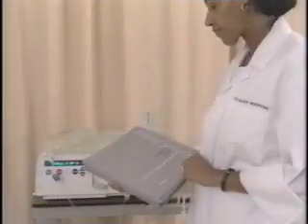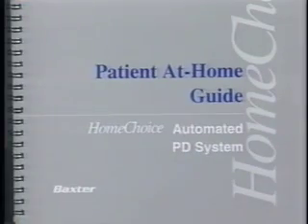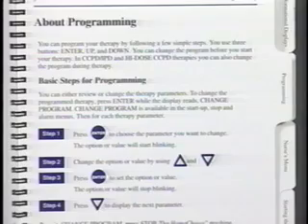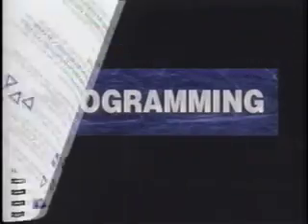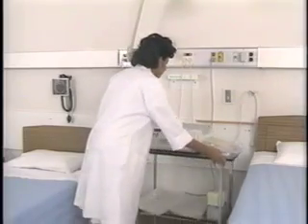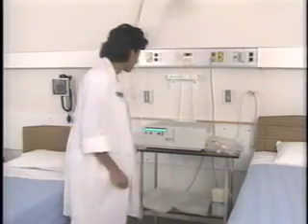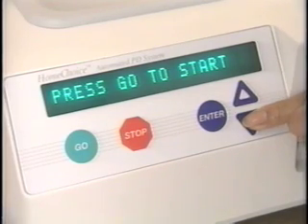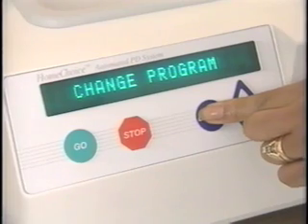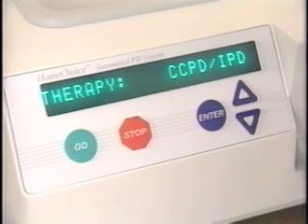The procedures in this section of the video are also outlined in the Patient at Home Guide and in the Trainer's Guide under Programming and Troubleshooting. For in-center healthcare professionals and patients setting their own programs, the following will be of assistance. When shipped, a new HomeChoice automated PD system contains a standard program. To change the program, press the down arrow until the display reads Change Program. Then press the Enter button.